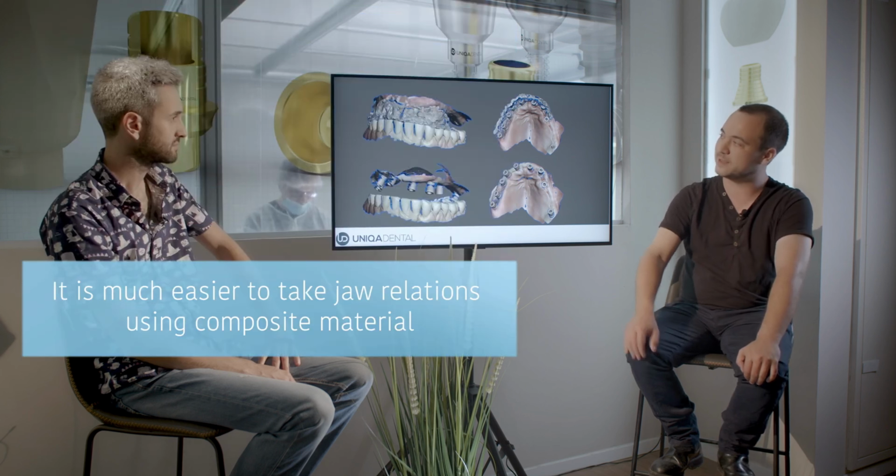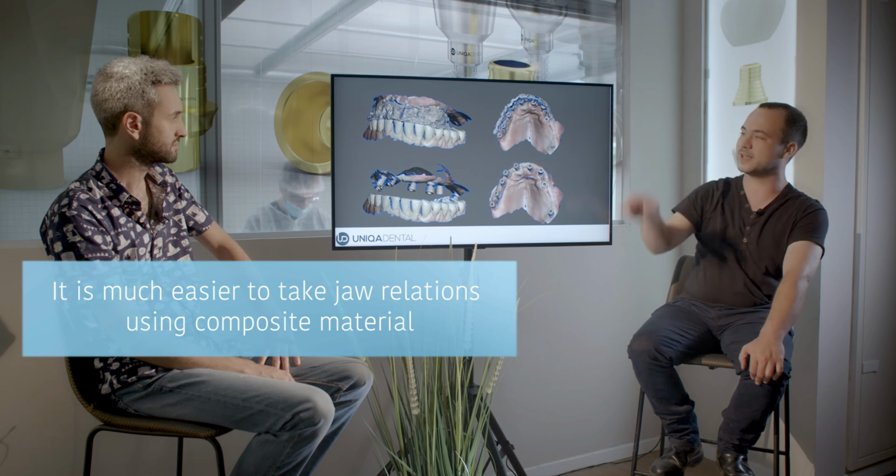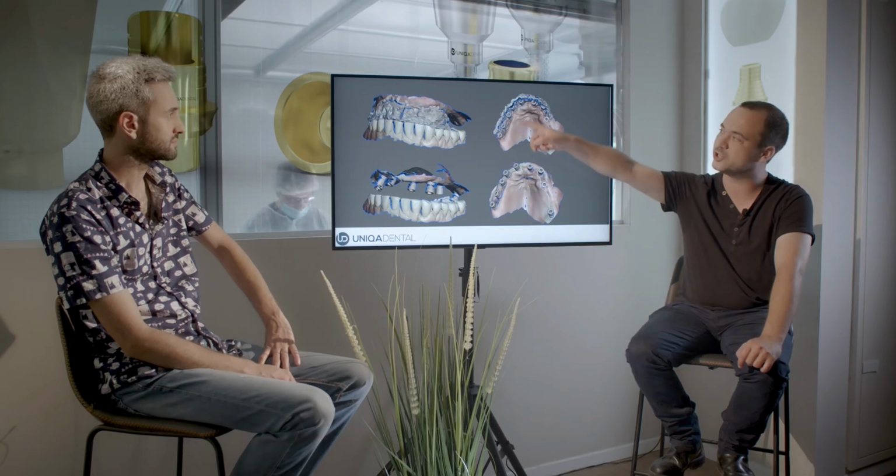We lay the composite material on the buccal side of the scan abutments. So what you have is the same scan abutments, but you have a rim of composite in the buccal part. The composite material is in relation to the lower jaw, so you have the indentations of the lower teeth, you have everything you need, you scan it, and you can place the clean jaw on top of the jaw with the composite material.